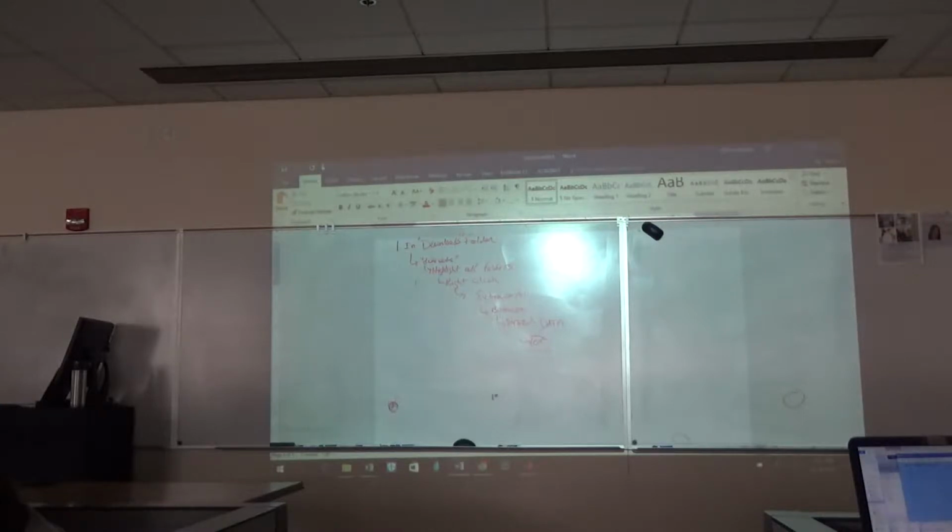What did you plot with your ERPs? Which conditions? Yeah, they're right there, right? So what do we want to use a topography map to see? No, we want to see the difference between them. That's why we did bin operations, so that we can subtract the bins. Okay. So we need to find a bin that's the subtraction of those two.